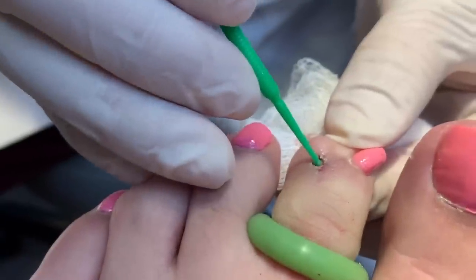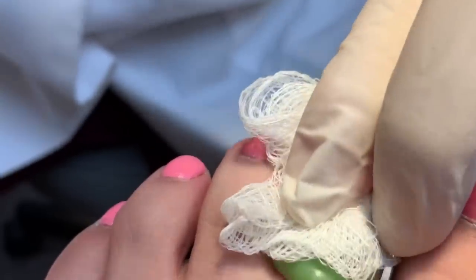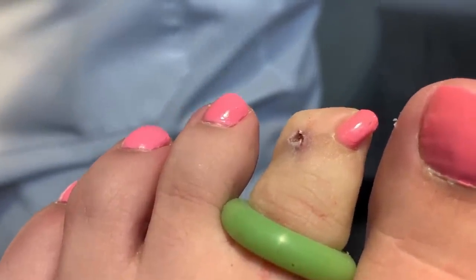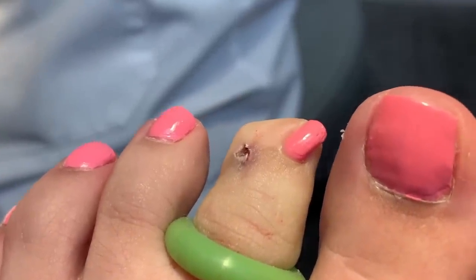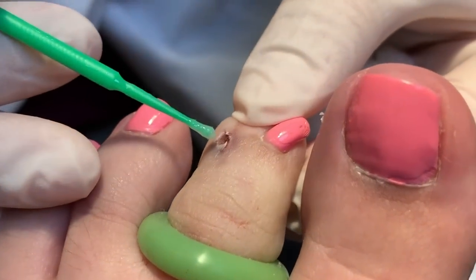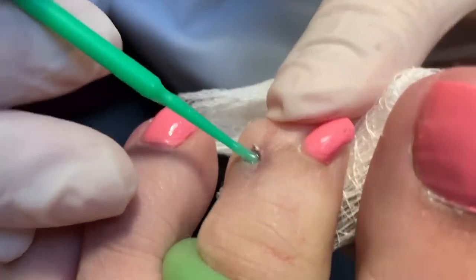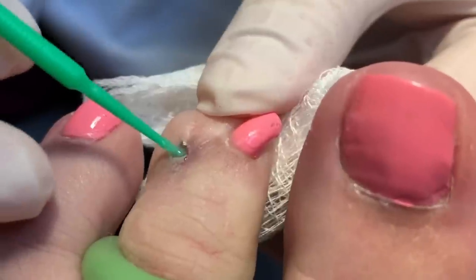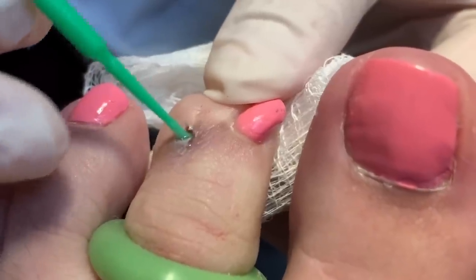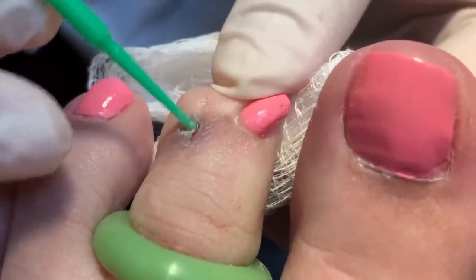So this little piece was bothering the patient, because even though there's a very small nail growing, when you're wearing shoes or socks it kind of irritates a little bit. So it's not extremely painful, but it's kind of bothersome. We had to fix the problem, so she's back and we're doing this. I see this maybe once or twice a year — it's not common at all, but it does happen. So when it happens, we need to fix it again. Hopefully by doing this, it won't grow back to irritate her — it's not painful, but something kind of sticking out a little bit is quite irritating.